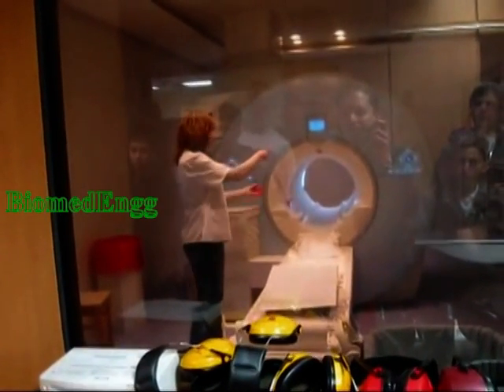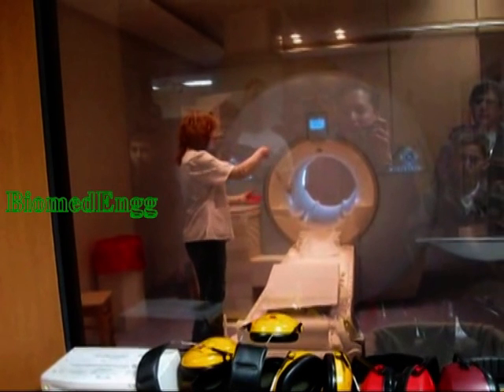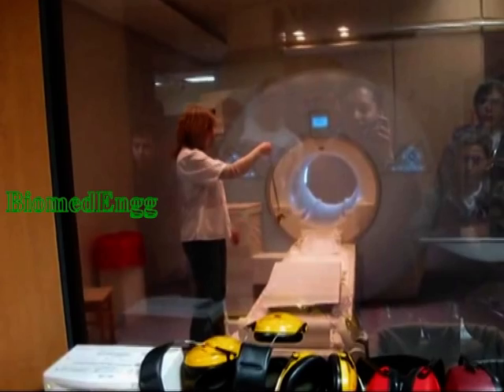This video is about how MRI — magnetic resonance imaging — is done. This is a display of the strong magnetic field at idle, demonstrated using a key. As you can see, the magnetic forces are very, very strong.